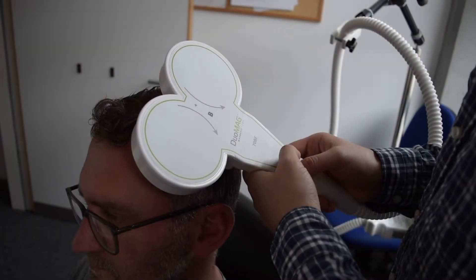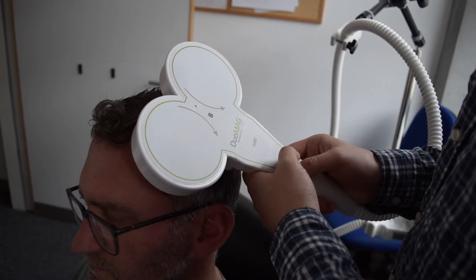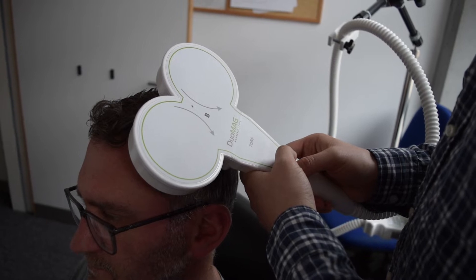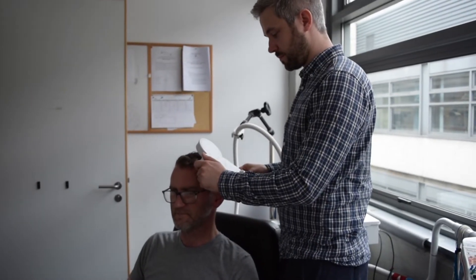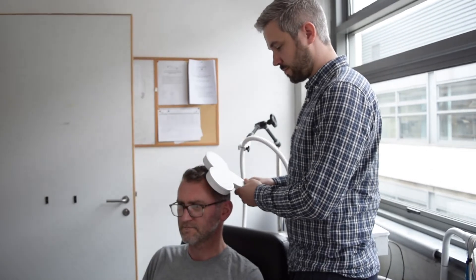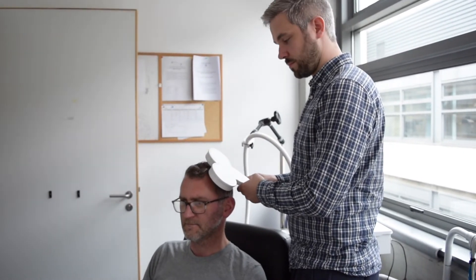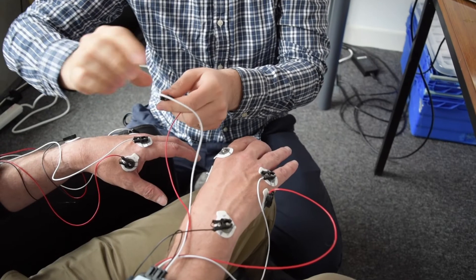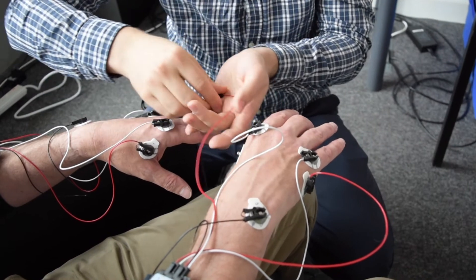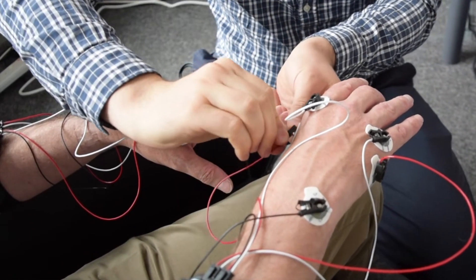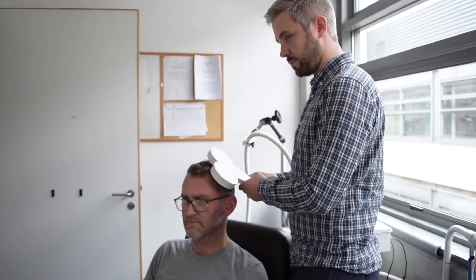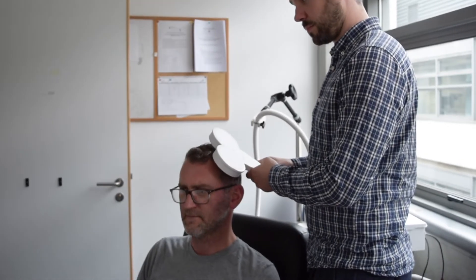TMS delivers brief magnetic pulses to the brain to stimulate neural tissue. In this experiment we place the TMS coil on the scalp location corresponding to the area of the motor cortex that controls hand muscles. If the intensity of the stimulation is high enough to discharge neurons to produce action potentials, a small twitch is produced in the corresponding muscles.